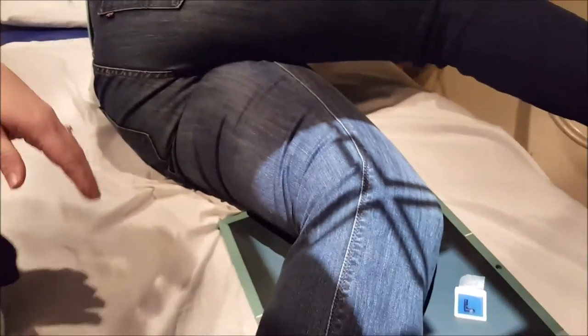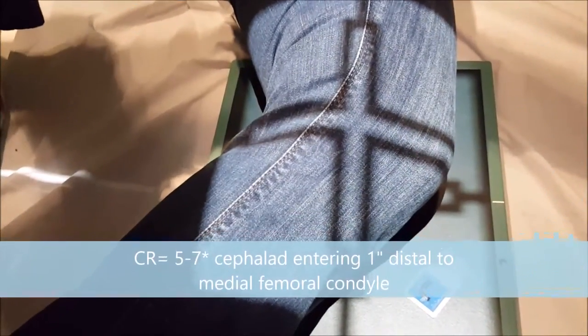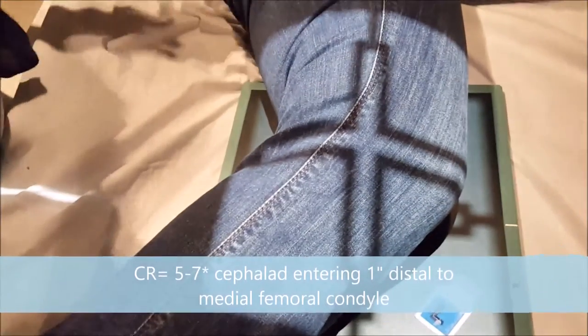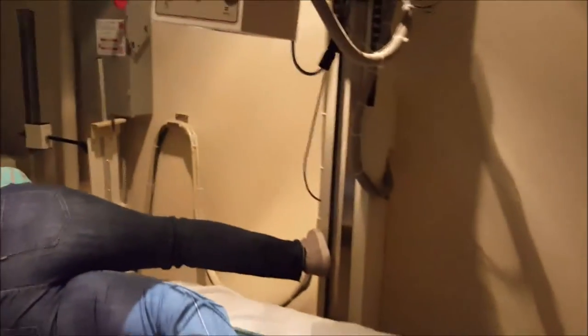You can also feel the epicondyles to make sure they're on top of one another. Sometimes, depending on your patient, that's a little harder to feel for. So I prefer to feel for the patella. I'm going to move the table down. And you want to be centered an inch inferior to the femoral condyles. And you can keep your 5 degree angle on the lateral. The lateral should have a 5 to 7 degree angle. But I think for our patient now, a 5 degree angle is sufficient. And that would be your lateral knee.